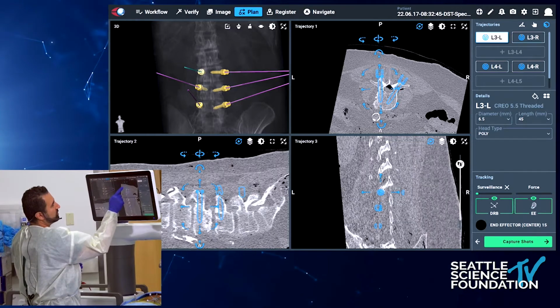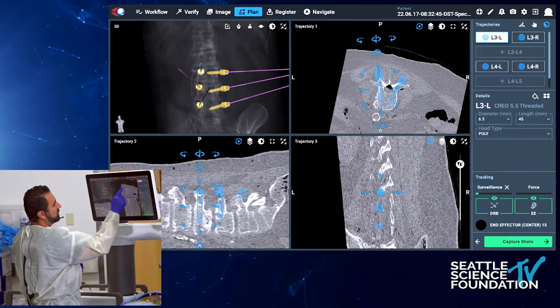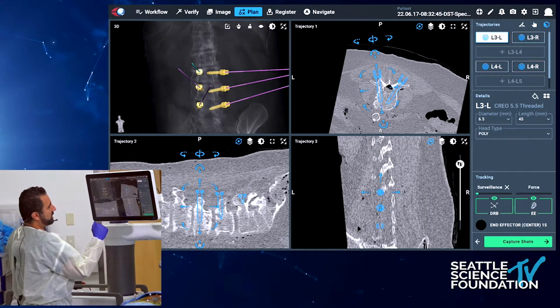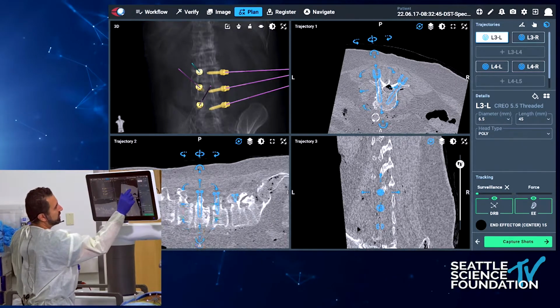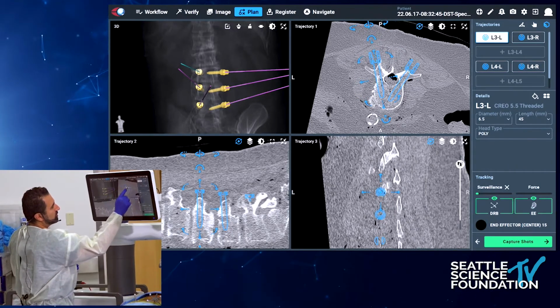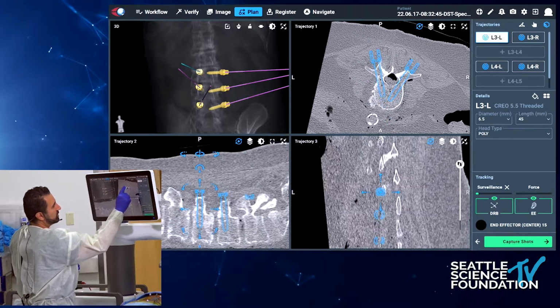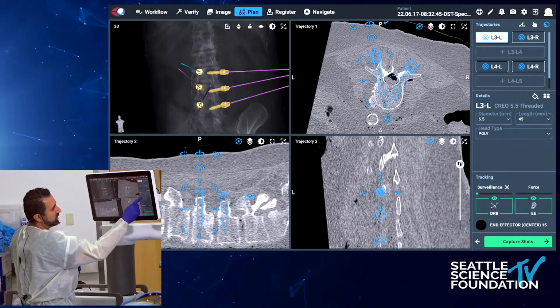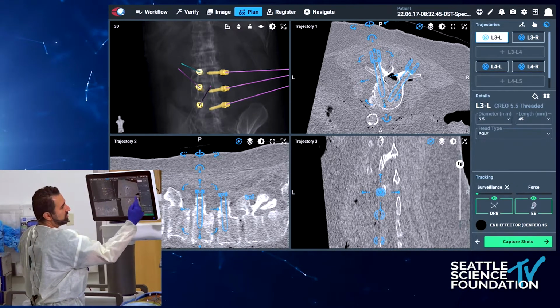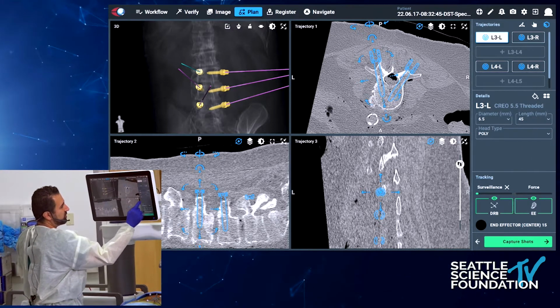I'm able to alter screw placement, and you can see the corresponding position of the screw head on the overlaid view of the instrumentation on the X-ray, and work it so that it's beneficial with respect to what I need to do. So I'm able to rotate and translate the screw. I can bring the screw in and out. I can lengthen the screw. I have the ability to change the diameter. We've picked a 6.5. I can change the length, for example, to a 40, 45, and so on.